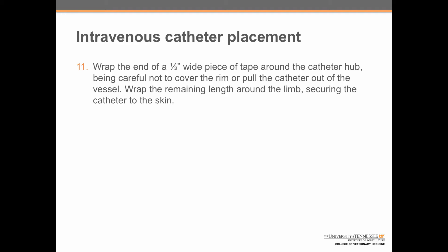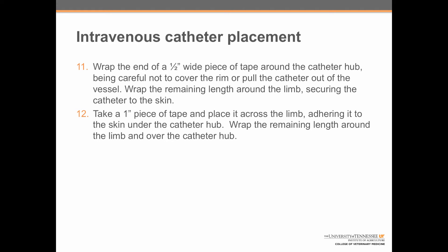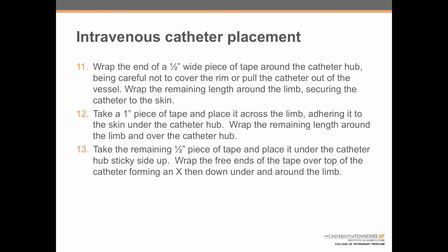Step 11: wrap the end of a one-half-inch wide piece of tape around the catheter hub, being careful not to cover the rim or pull the catheter out of the leg. Wrap the remaining length around the limb, securing the catheter to the skin. Step 12: take a one-inch piece of tape and place it across the limb, adhering it to the skin under the catheter hub, then wrap the remaining length around the limb and over the hub. Step 13: take the remaining half-inch piece of tape, place it under the catheter hub sticky side up, wrap the free ends over the top forming an X, and then down and around the limb. Step 14: slowly flush the catheter with saline to confirm its patency.